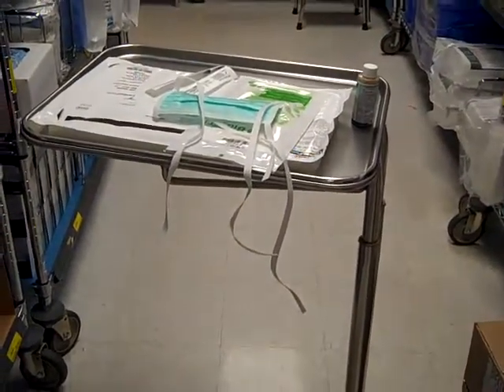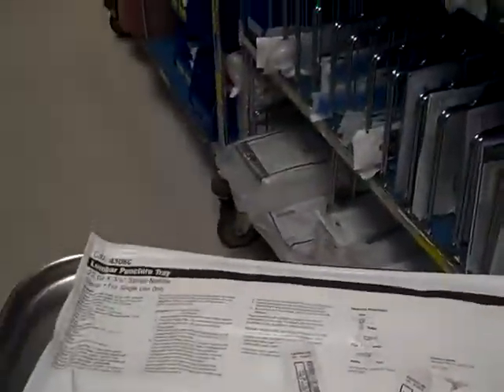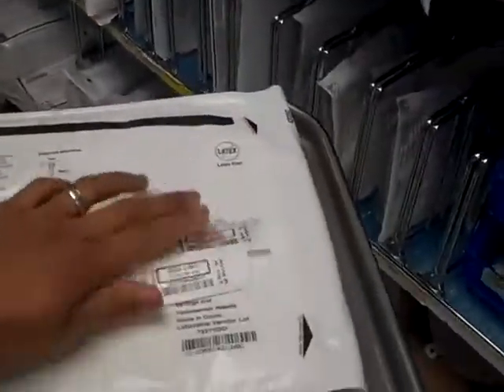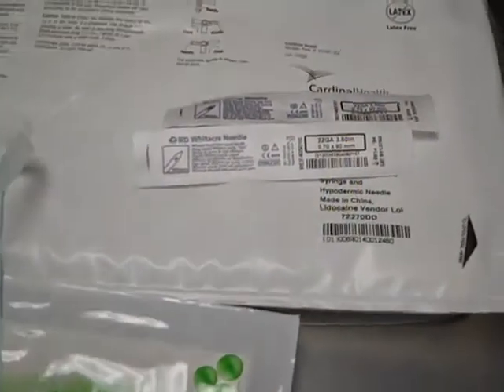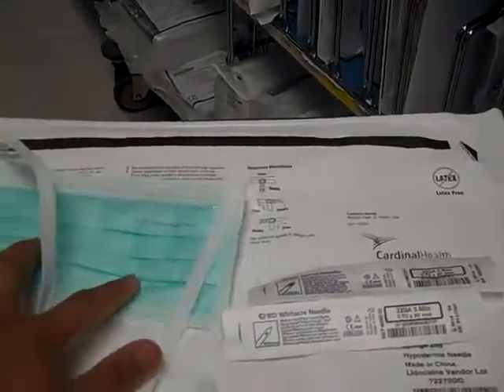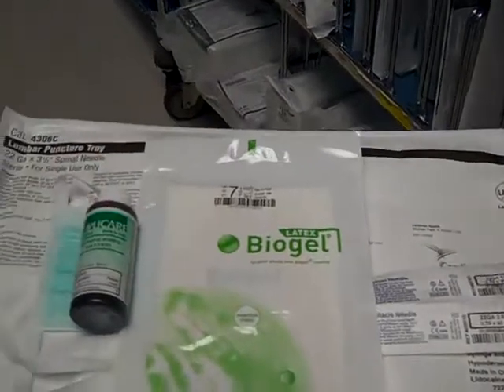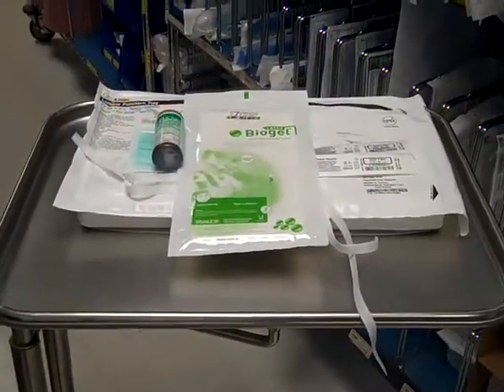So it's that combination of things. It's the LP kit, which is located on the right hand side; the combination of the two different kinds of needles — blunt or cutting; a mask; gloves; and Betadyne; and then a bunch of blankets on a mayo stand, and you're ready for an LP.